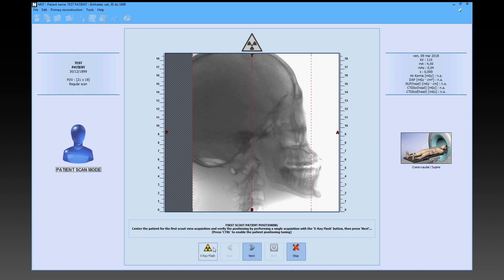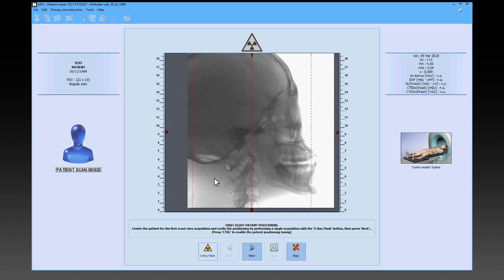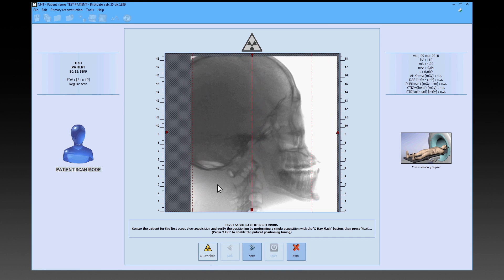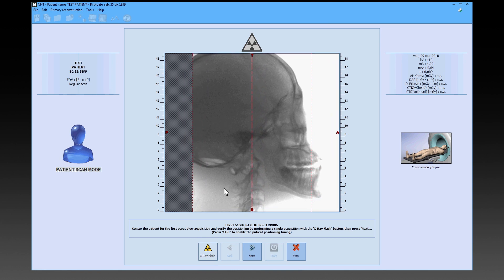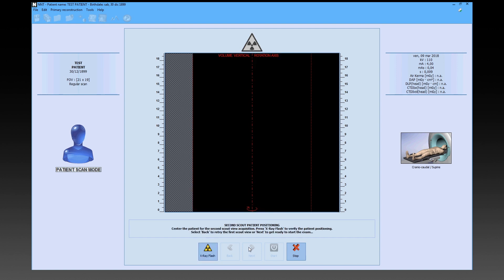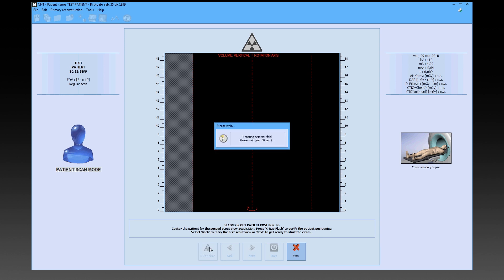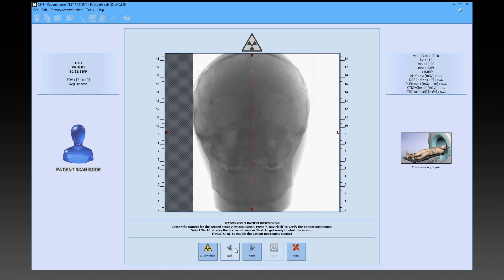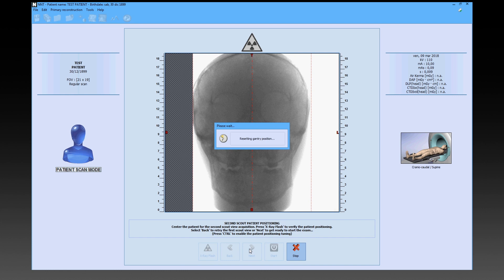The scout image will then be displayed on the screen, allowing the patient's position to be adjusted by holding down the control key and moving the image with the mouse. After completing any required adjustments, a new automatic scout image will be obtained to be checked. If no further adjustments are needed, by pressing Next you will switch to the front scout image and the same procedure should be followed.